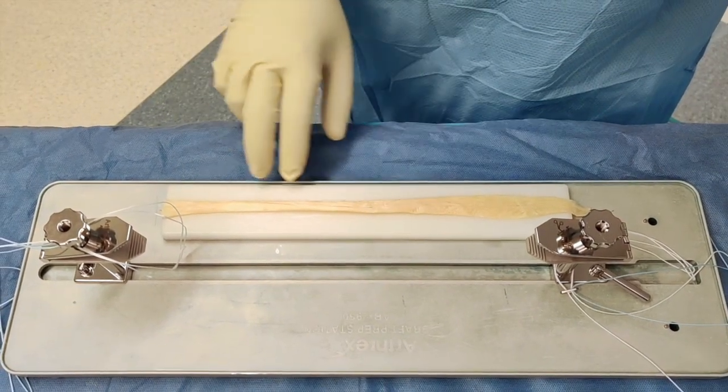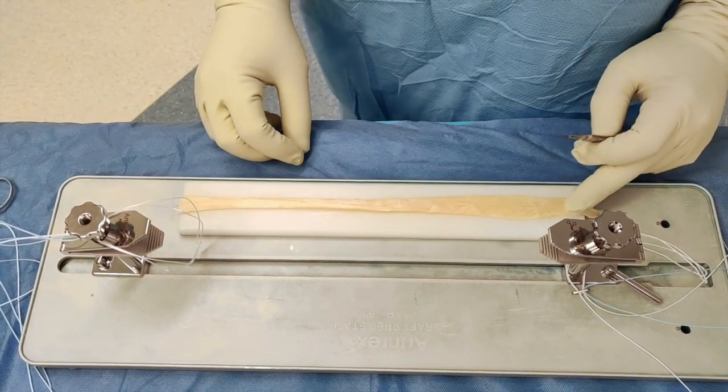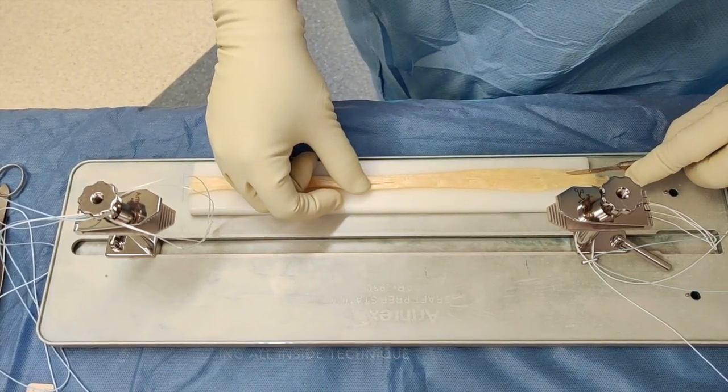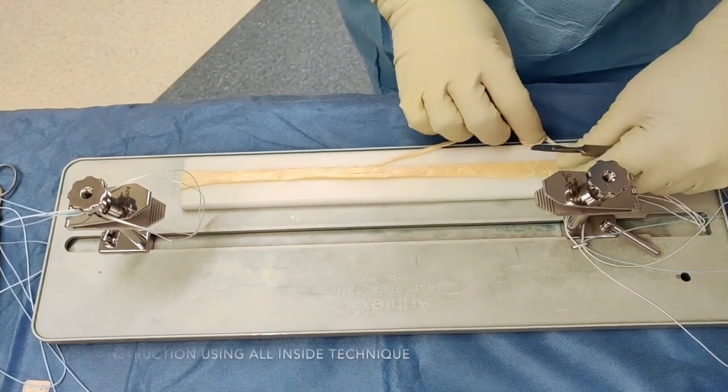After folding the graft, I trim it to the desirable size for implantation. Ideally, the graft size should be 10-11 mm in diameter in a male. I remove one third of the proximal part of the graft, and that should give us the desirable size.